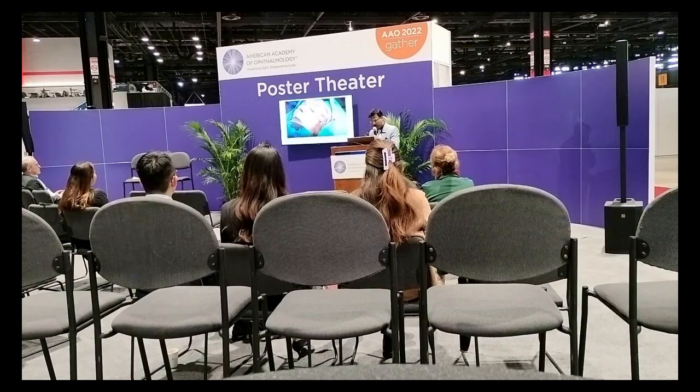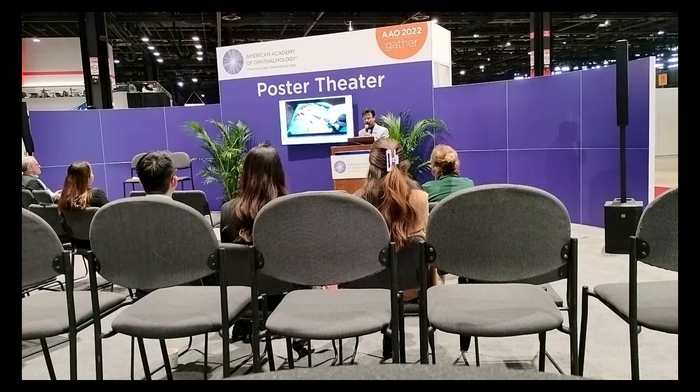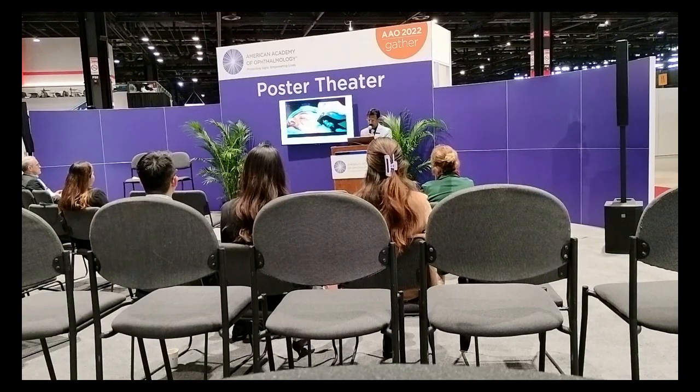Now you see, this is the design of the incision. This patient needs a muscle flap, but with the expander, we use only a rotational flap. This is a scar revision surgery with a lower lid cicatricial ectropion. Again, the MRD value is much higher. Then again, you mark this ellipsoid area over the bony surface. Again, the same procedure: inflate the skin muscle complex at a time.